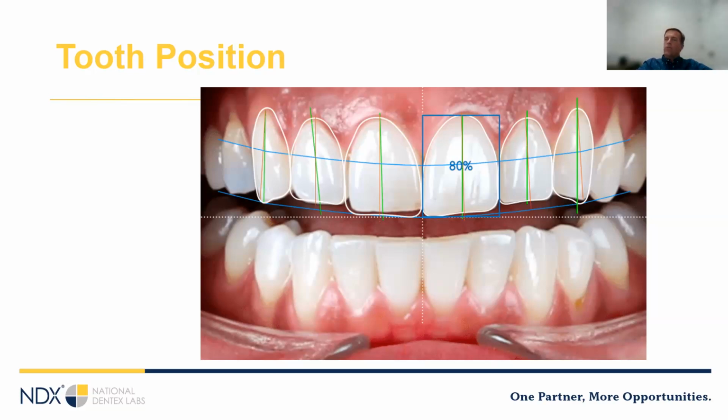A good general rule of thumb when you're looking at your overall anterior contour is that it should be convex in every dimension on the labial surface. In other words, it should be convex, gingival to incisal and mesial to distal. It can have some little concavities here and there for contour, but if the overall shape is concave, it makes the tooth look weird. You look at the tooth and you're like, well, it should look right, but it doesn't. And sometimes if you turn that restoration at an angle, you'll see, oh, looks like a little ski ramp on the facial. That's what's wrong with it. So that can be really important.